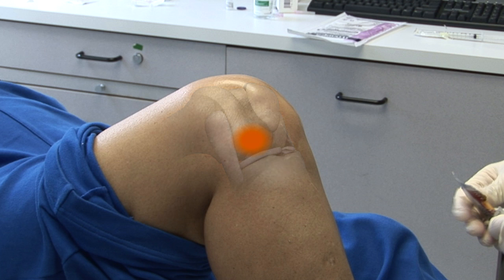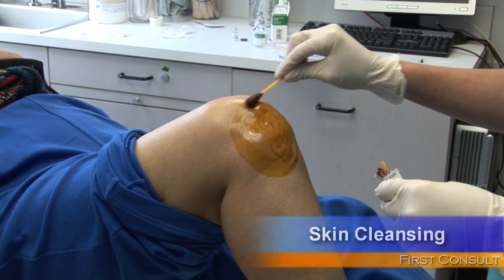In this patient, the inferior lateral approach was selected. Thoroughly clean the skin overlying the knee with an antiseptic solution.